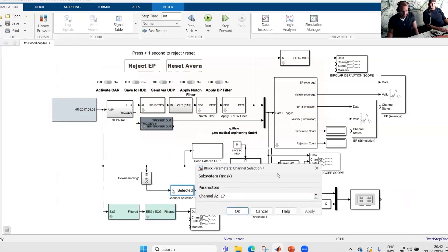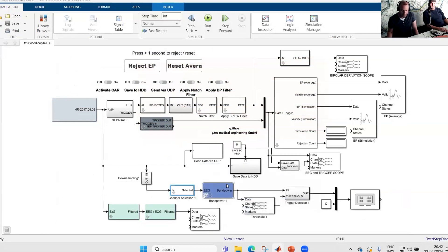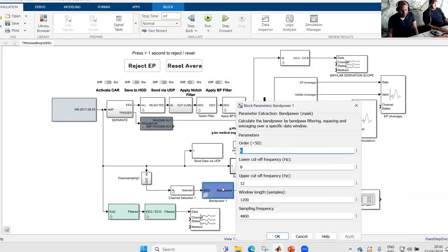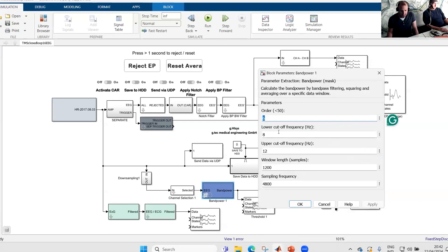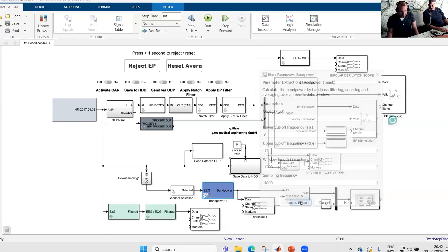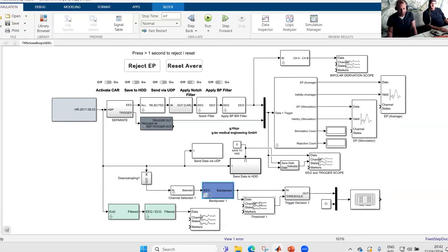More important is our selection for the triggering of the device. We select channel 17 — that's the one in the back of the head because there we usually observe higher alpha activity. Then we calculate the band power of the signal with a lower cutoff frequency of 8 Hz, upper cutoff frequency of 12 Hz, and we select a window of 1,200 samples at our sampling rate of 4,800. Then we use our threshold scope, which allows you to change the threshold value on the fly. Whenever this threshold is reached, a trigger is generated automatically, and then we send the trigger to our stimulation box.